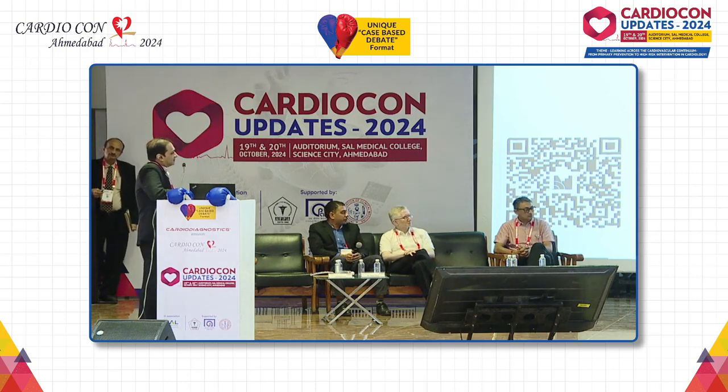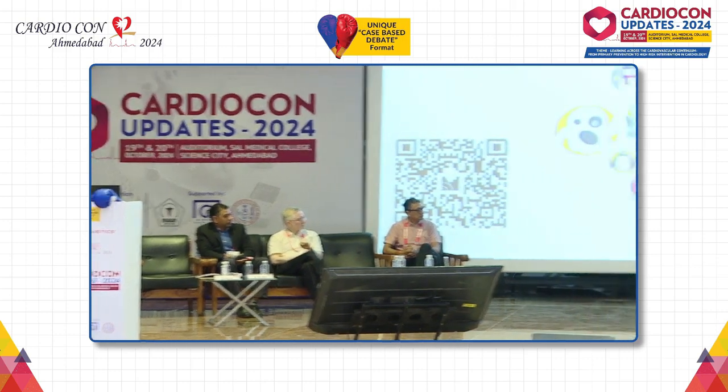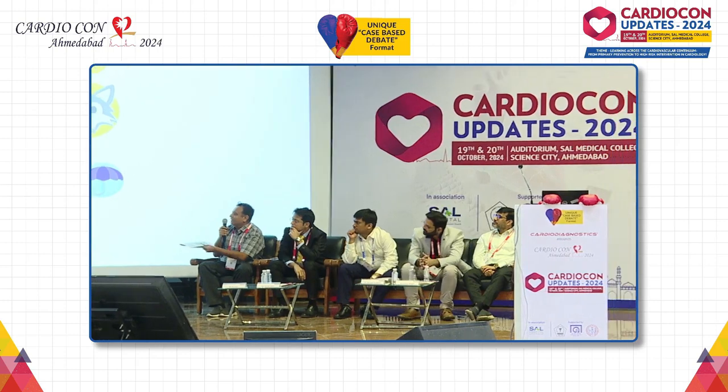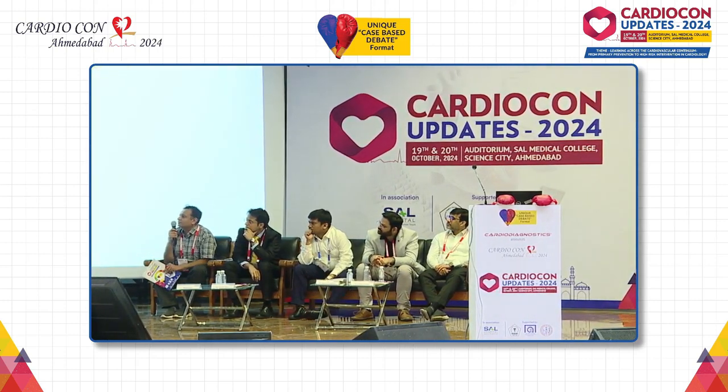Especially what Sir said about critical calcium lesion, when you cannot use the IVL, then you initially use rotational atherectomy. And then if you do imaging again, if you find this still residual calcium is there, and if you think the stent won't expand, then you use the IVL after doing rotational atherectomy, to use rotatripsy to get better outcome in the result of the long-term stent.